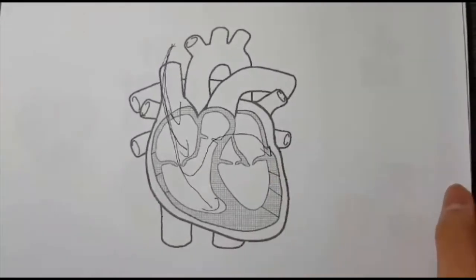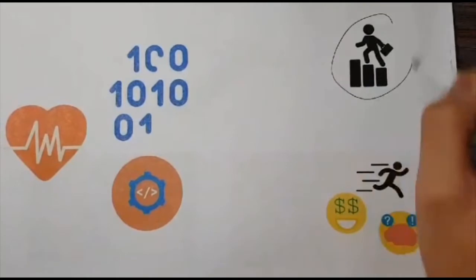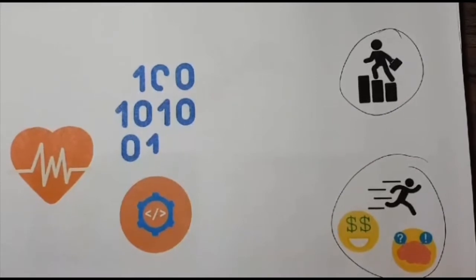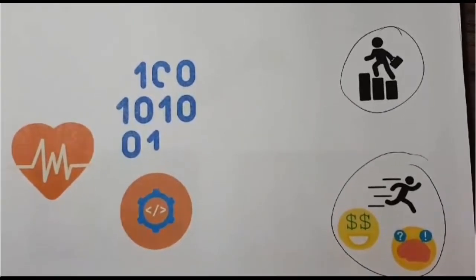This allows coordination across the entire heart, but is only recommended for patients with severe heart failure. Now, pacemakers come in two main programmable forms dependent on the patient's situation: on-demand or rate-responsive. On-demand pacemakers only send electrical impulses if the sensors in the electrode detect too slow of a heart rate or if it misses a beat.